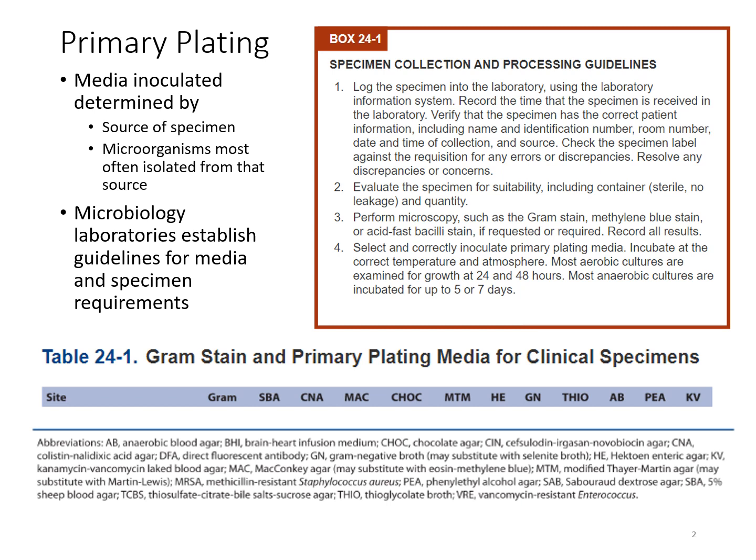Some physicians may request a gram stain on something that you wouldn't normally do a gram stain on. So you want to be sure that you're looking for that and documenting those results, because as you recall, a gram stain is going to give you that first early indicator of what the potential organism is that you are dealing with in that sample.